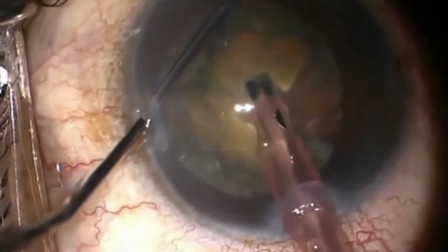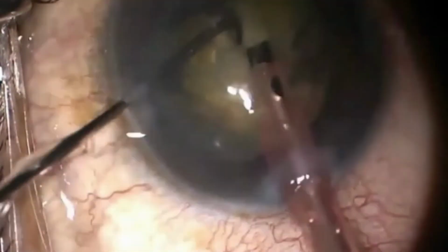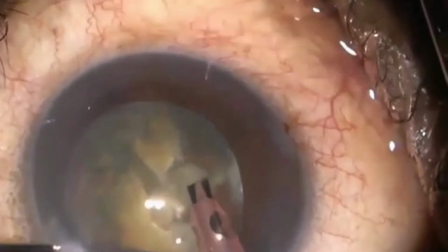The harder the nucleus, the smaller the fragments and, consequently, the higher the number of fragments. For a medium nucleus, 4 to 6 pieces should be created. The fragments are then emulsified.